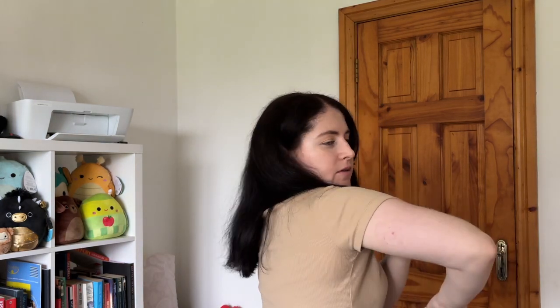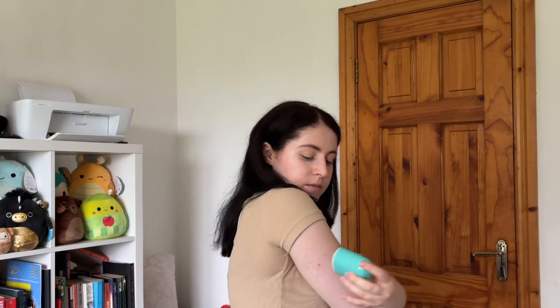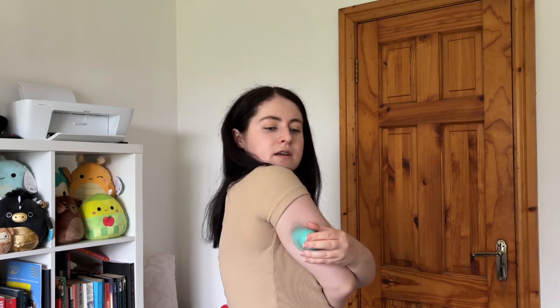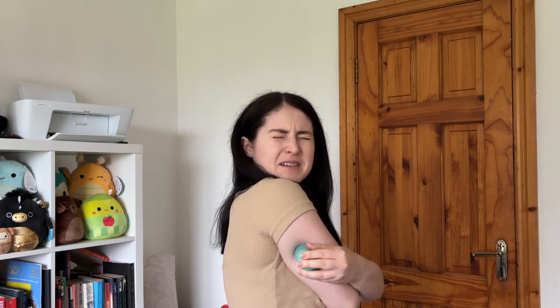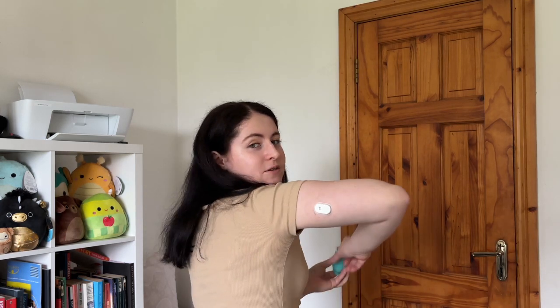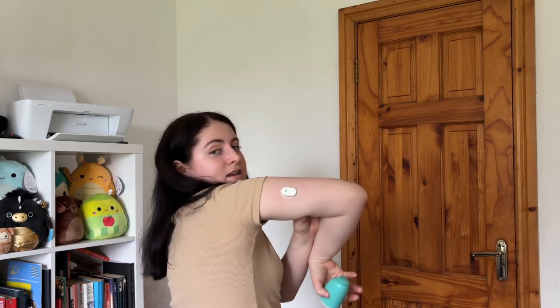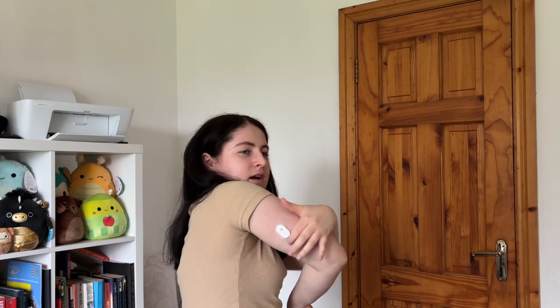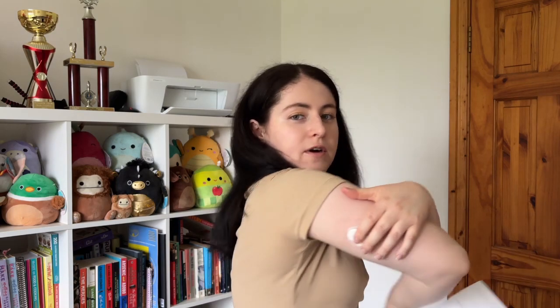I'm going to be doing it on the right arm because the Dexcom is on the left. So far I can see it's only approved to do it on the upper arm — not on the stomach like you can with Dexcom. Here we go. One, two, three. Oh, they always make that noise — I hope it worked. I think it worked! How's it looking guys? I can't even see it. It says smooth over like that — I need to go have a little look in the mirror. I am liking it so far.